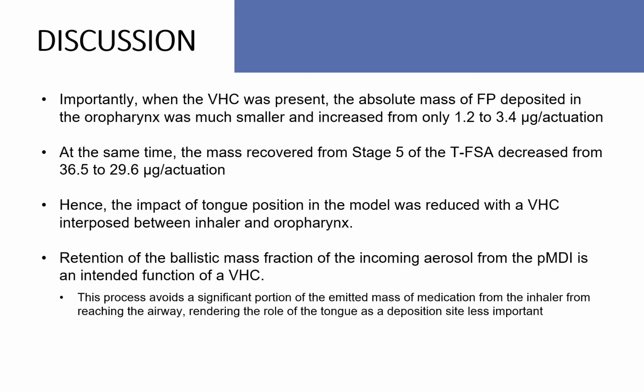So when the spacer was present, the mass of fluticasone deposited in the oropharynx was smaller and increased only from 1.2 to 3.4 micrograms, while at the same time the mass recovered from stage 5, again, hopefully that represents lung delivery, decreased from 36.5 to 29.6 micrograms.